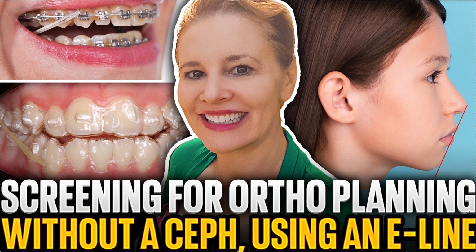And as you scale up your ortho in your office, whether you do kids or adults, especially kids, you're going to be more likely to need one. With adults, you can definitely get away with just a CBCT with a smaller field for most situations because you aren't doing growth major cases, where you're doing growth and development or guided growth or anything like that. So I always encourage my doctors, again, to follow their Dental Practice Act and their state or country of licensure, but just for screening, using the E-line, which is this over here, the good old E-line is a great way.